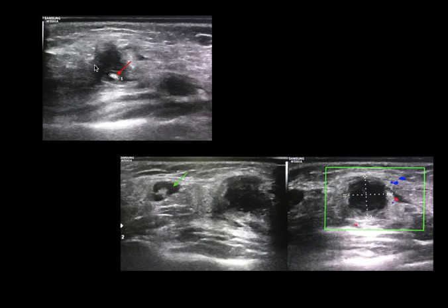Adjacent to the site of this echogenic focus, you can see a well-defined hypoechoic area which is heterogeneous but not yet completely hypoechoic, suggestive of an evolving abscess. You can also see another small intraparotid lymph node with maintained fatty hilum.